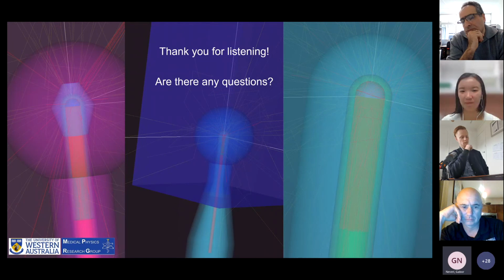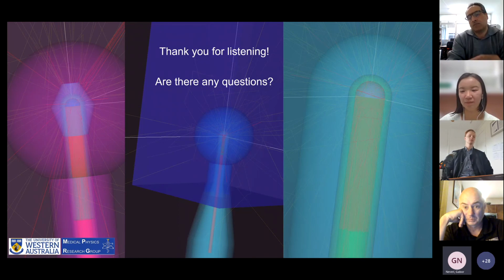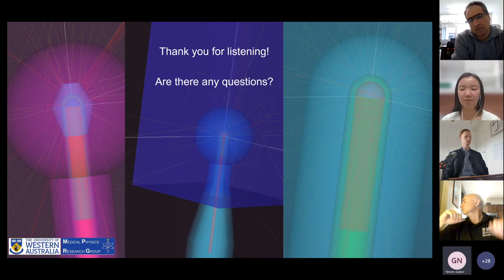We use it as our standard, but again I would say within 5%. I think Monte Carlo and the film measurements are below 5%. We can't validate beyond saying we are good within 5%, but I think Monte Carlo and the actual film measurements could give you better results. Previously we didn't have the tools to validate it, and we had a lot of conversation with Zeiss about what they state and what we measured and what was wrong in our measurements. This was the end result: Gottfried's plastic isotropy phantom.